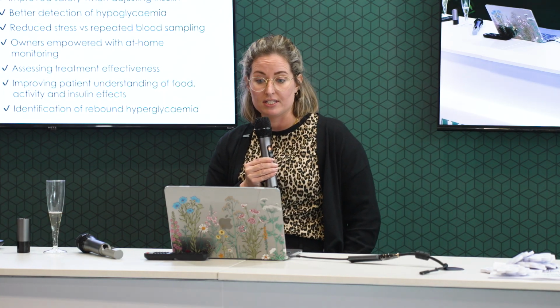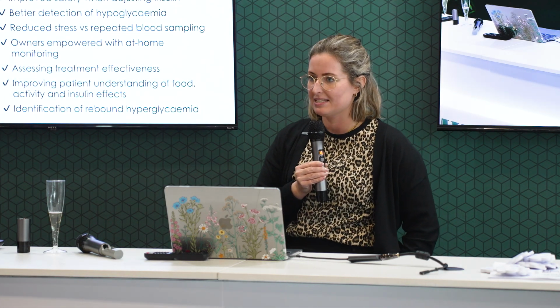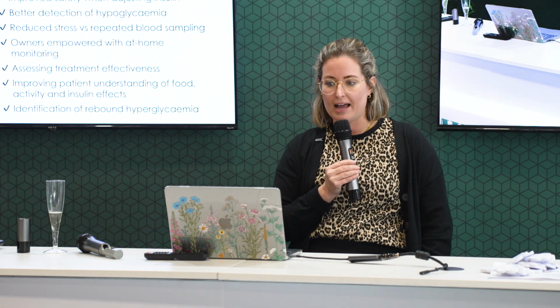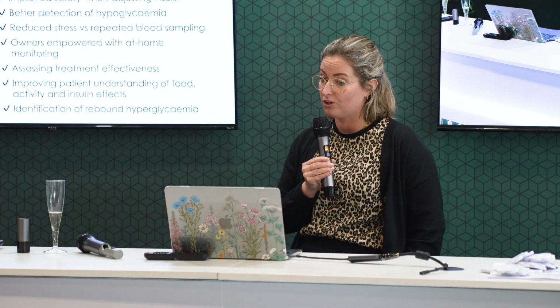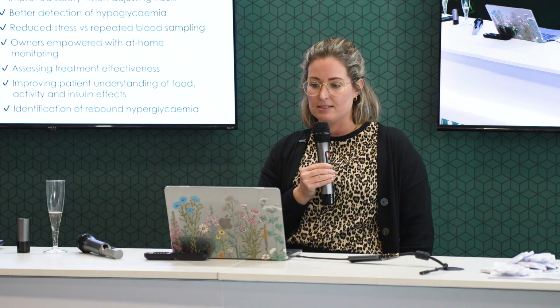So we might have owners, particularly as these patients are newly diagnosed and the owner's trying to get their head around diabetes and management of diabetes, and this can be quite scary. So being able to say to someone, if the patient is acting a little strange, and they're able to access what that interstitial glucose is, that can bring them some reassurance and some peace of mind.